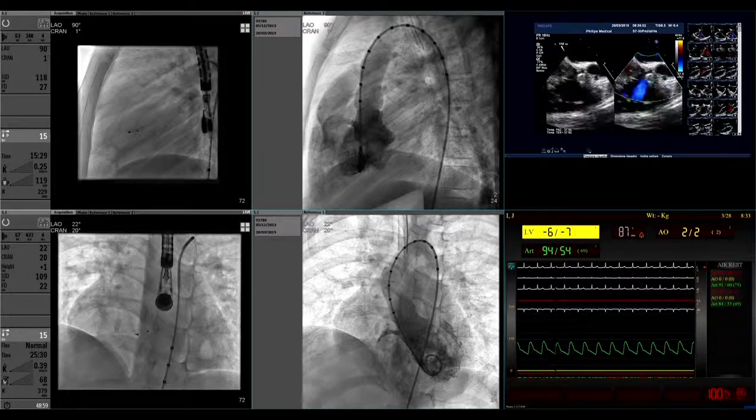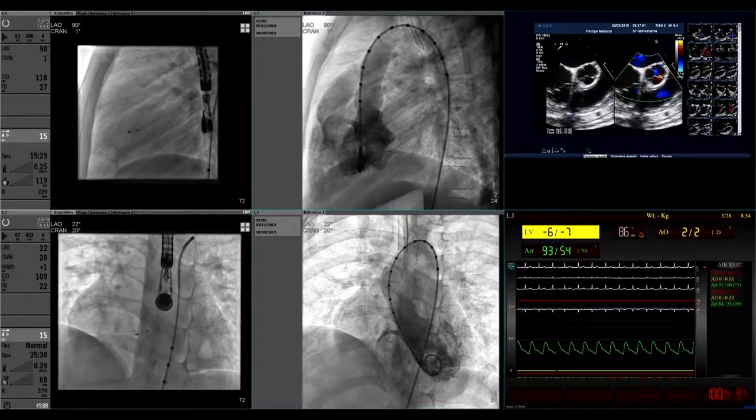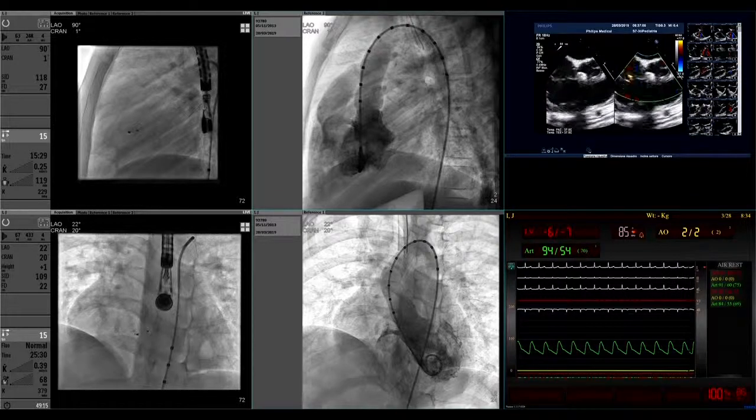Mario, this is Carlos. Let me ask you a question. How do you manage these patients in terms of surveillance for heart block, like the Holter, standard ECG, telemonitoring? What's your policy here in San Donato?